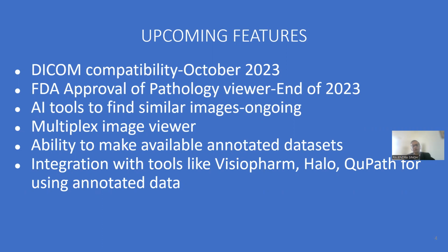It can also already be integrated with Visiopharm, but we are also trying to integrate with other platforms that you would like to use for the annotated data.